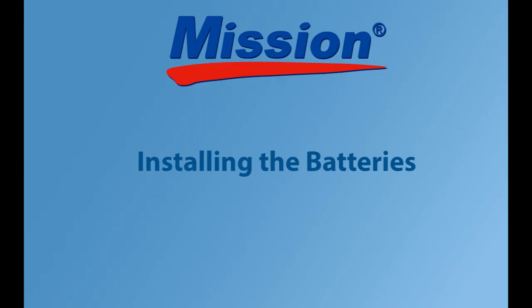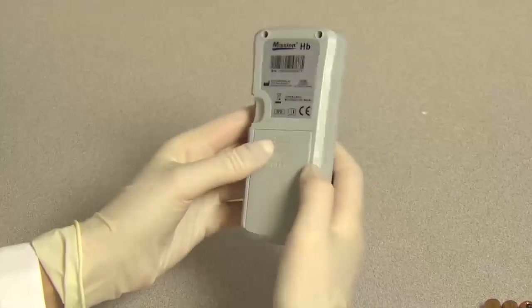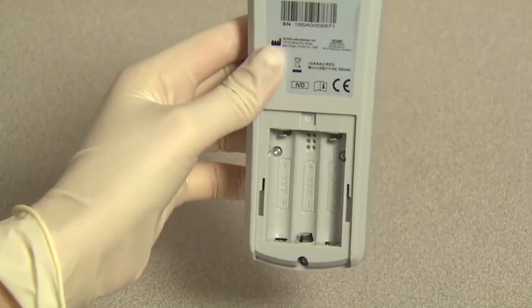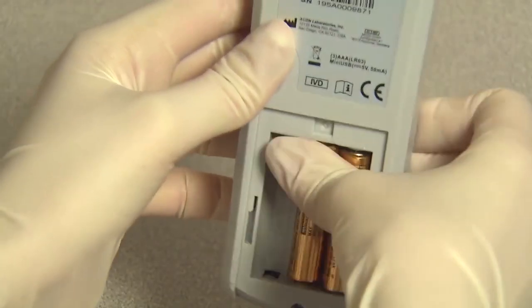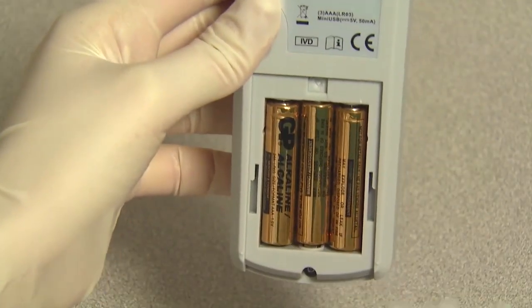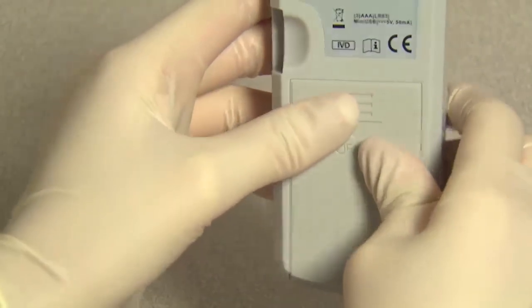To install the battery, turn over the meter to locate the battery compartment cover. Press in the direction of the arrow on the battery cover and slide the cover down to open it. Insert three AAA batteries into the battery compartment. Close the battery cover and make sure it snaps shut.